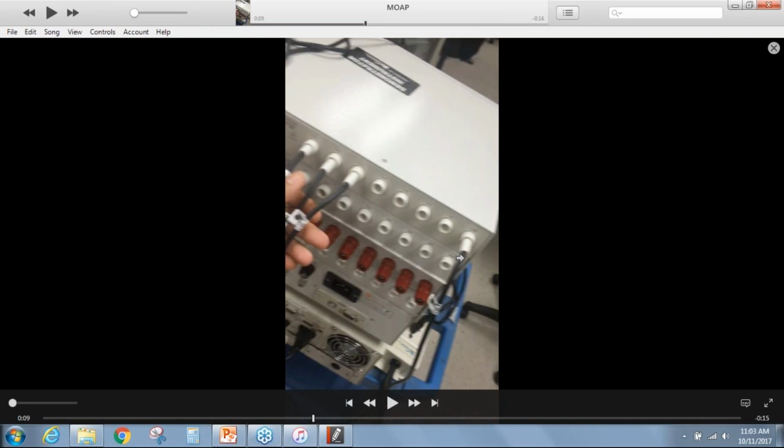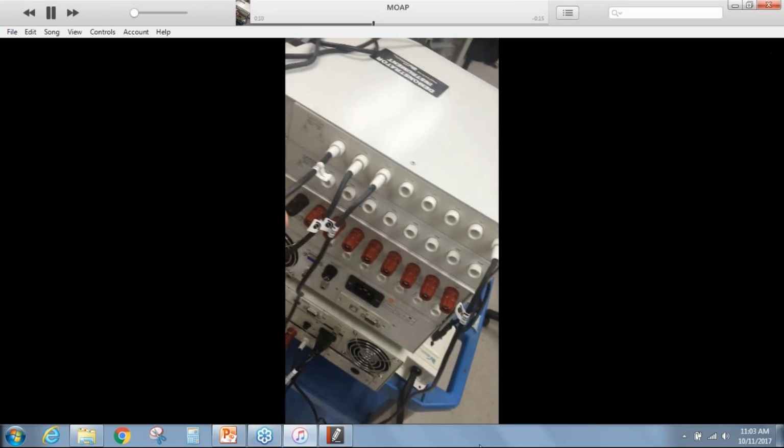So I'm taking line, neutral, and ground from my T2 source, and I'm going to be able to connect that to one of the applied parts through my measuring device using these scanning matrices. So I could have this point connected to this point with the scanner in the correct mode, and then I could have these two shorted together to create this mains and applied part test that's required. Again, this could be called a fully automated test as long as you're using some of these scanning matrices to run your test.